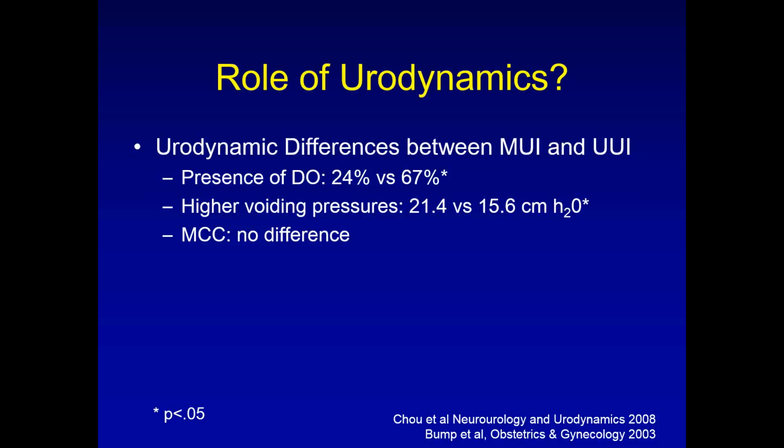But the difference between 16 centimeters of water pressure and 21 centimeters of water pressure isn't that high. So there are really not that many urodynamic findings that are going to say, oh, this is an obvious mixed incontinence picture, this is an obvious urgent incontinence picture, this is an obvious stress incontinence picture. On the other hand, what you're going to be using the urodynamics for is to really rule in, rule out, make sure they don't have something bad, and compliance would be the worst one. Or you've got the patient with stress incontinence and she's got such severe overactivity that you're looking at her and it's like, I don't even see how you could have stress incontinence because you can't hold more than 30 cc's in your bladder. So that's where urodynamics will help you. But if you're looking for urodynamics to have a result that says it's an obvious mixed incontinence picture, you're not going to see that.